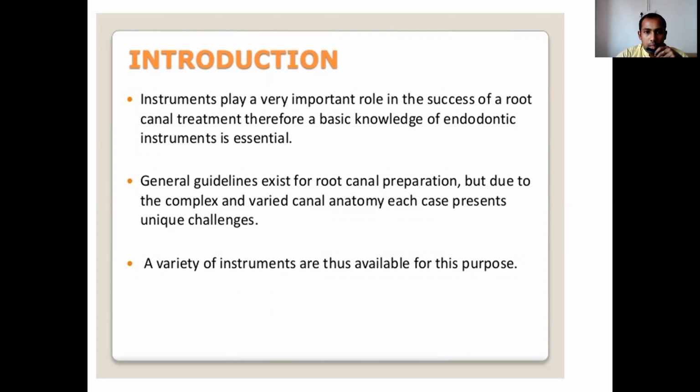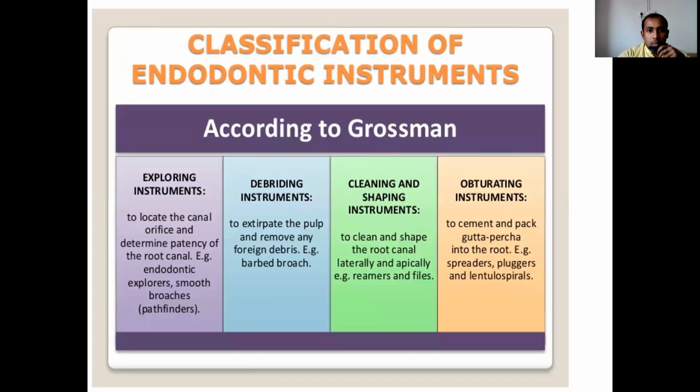Regarding the guidelines which exist for root canal preparation, because of the complex and varied root canal anatomy, each case is very different and presents unique challenges. So a variety of root canal instruments are available for this purpose. We'll be discussing them shortly. And before discussing instruments in detail, let me discuss the classification of endodontic instruments proposed by Grossman.